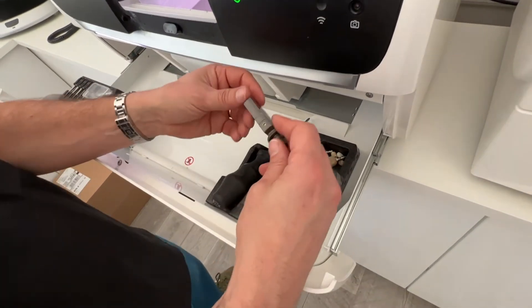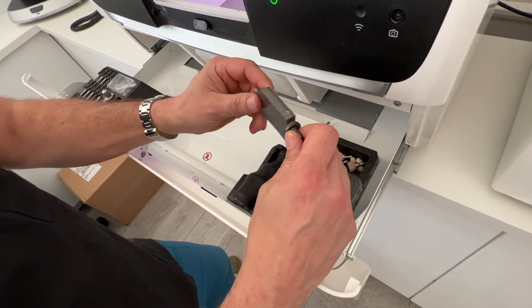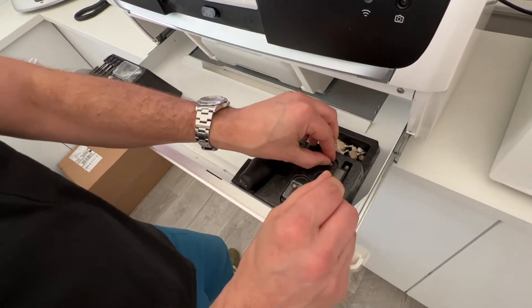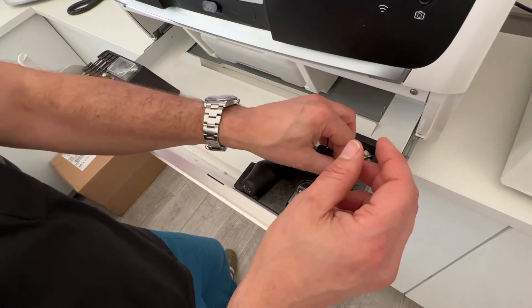Importantly here also we have a calibration tool. Make sure you use the correct calibration tool for the machine as well — don't get them mixed up. And then we have the little sensors here that we use instead of burrs when we do the calibrations.